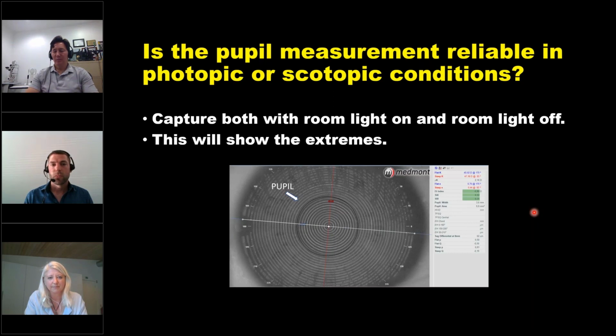Do you use the pupil diameter often or routinely? What are your thoughts? I follow Meta on this. One additional thing is that it's very valuable when you're doing topography on top of a multifocal lens, where you can see the add power in the lens, and then you can see if it's really centered over the pupil or not. This will also give a good indication if you're having a reliable fit or will achieve good visual quality with that multifocal lens, or if you'll have to change to another lens, for example.